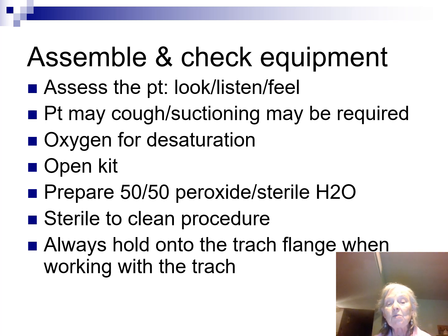The other thing is when you're either removing the inner cannula or putting the new inner cannula in, you need to stabilize that flange, because if you're pulling it out and not stabilizing the flange, now you're pulling on that outer cannula. It's going to move up in the airway. When you're putting one back in, if you're not holding that flange, you're pushing that trach now into the airway, and this patient's going to cough, and this patient's going to have some issues with you.